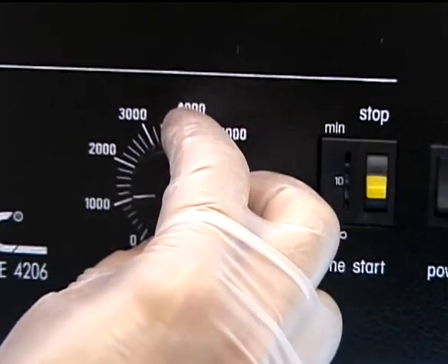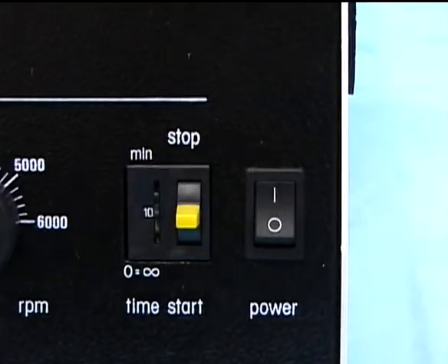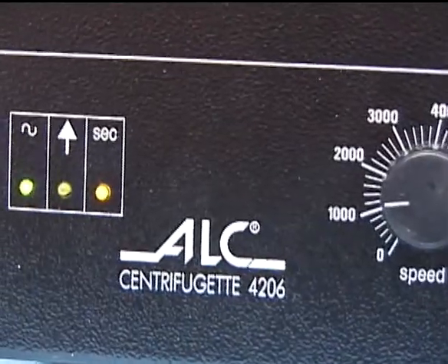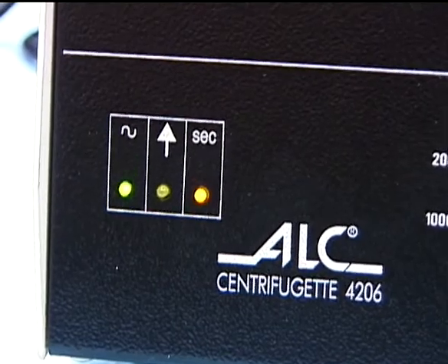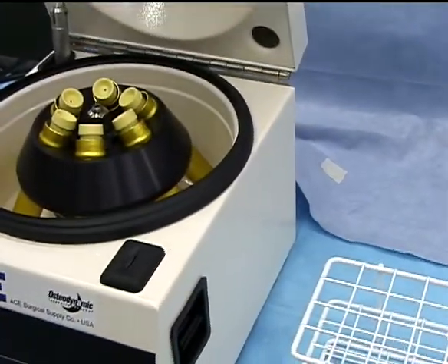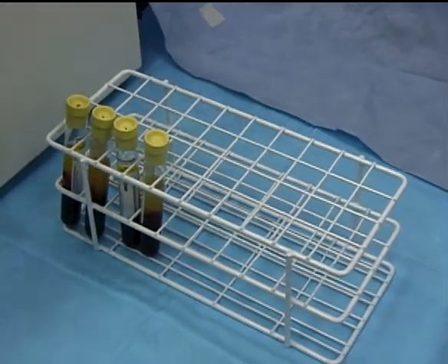The spin is started by depressing the yellow toggle switch on the front right of the centrifuge. The motor is extremely quiet, but is in the spin mode when the green light illuminates once per second. This is seen on the left side of the front face controls. After the first 10 minutes of centrifugation, the yellow top tubes are transferred to the tube rack.